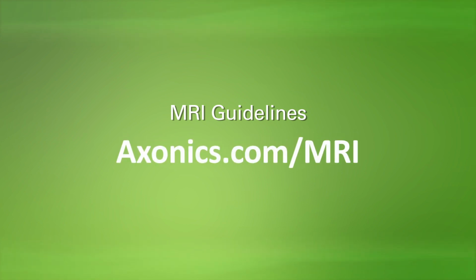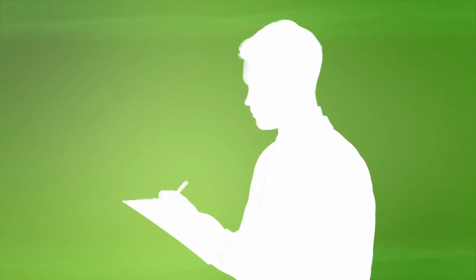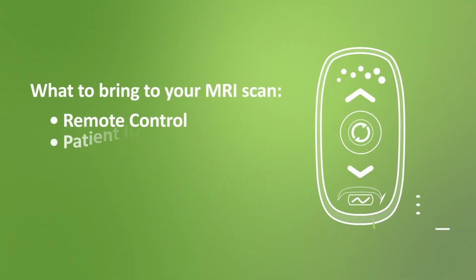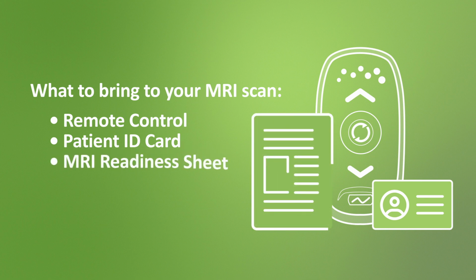MRI guidelines, including the conditions for safe MRIs, are available on our website at axonics.com/MRI. Your MRI technologist will review the MRI guidelines, and if you or your MRI technologist have any questions, you can contact your Axonics clinical team member to get your questions answered. And remember to bring your remote control, your patient ID card, and your MRI readiness sheet to make your MRI appointment go as smoothly as possible.